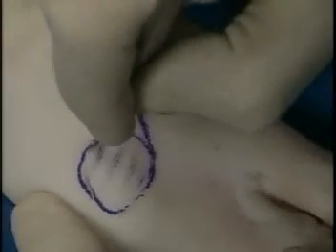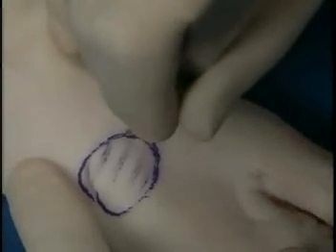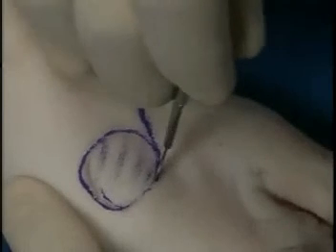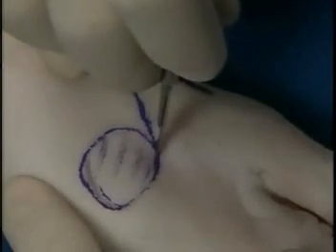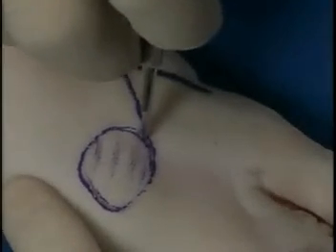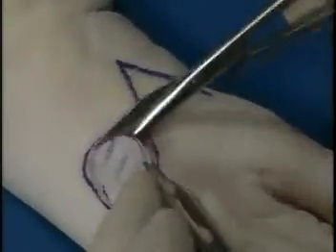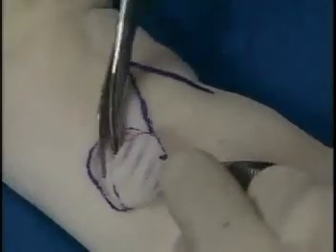Here we see the defect. An incision is being made around the defect, and then the limbs of the note flap will be created by making a line as a tangent approximately 1.5 times the length of the diameter. Here we see the lesion being excised.